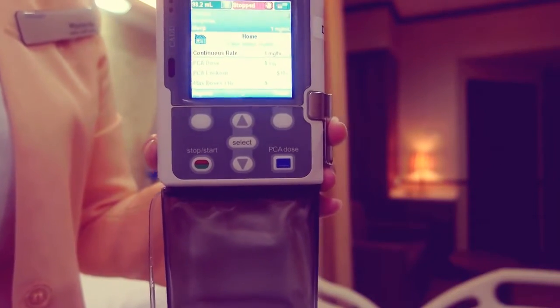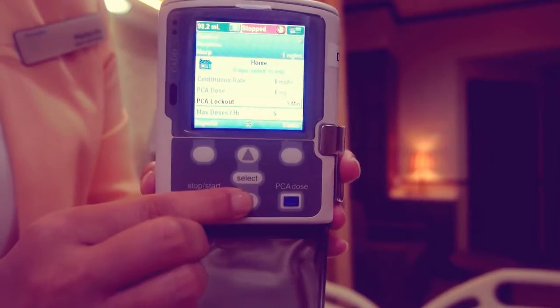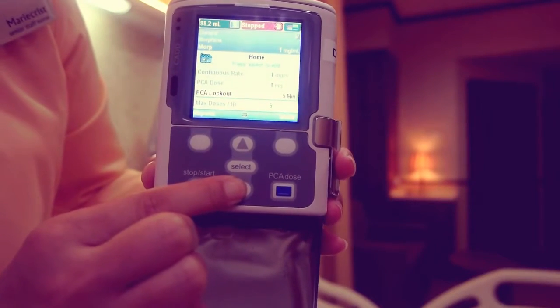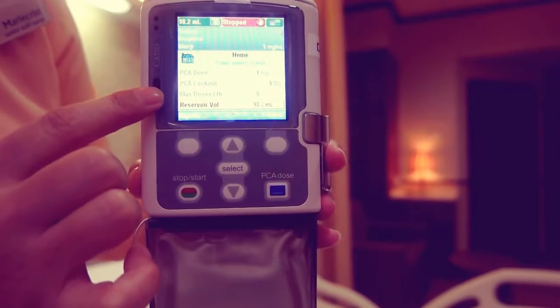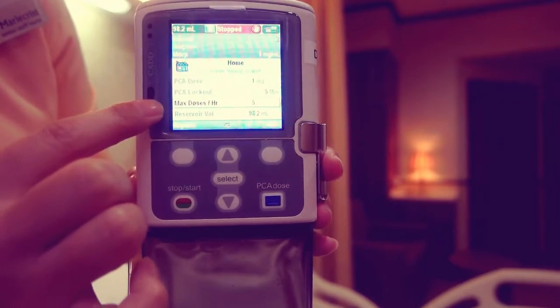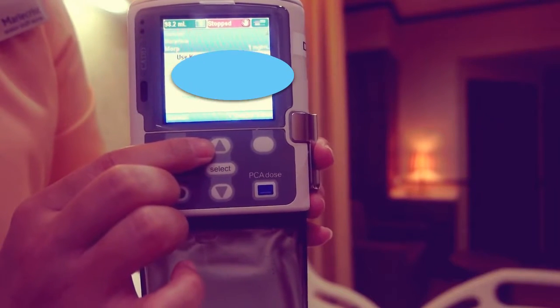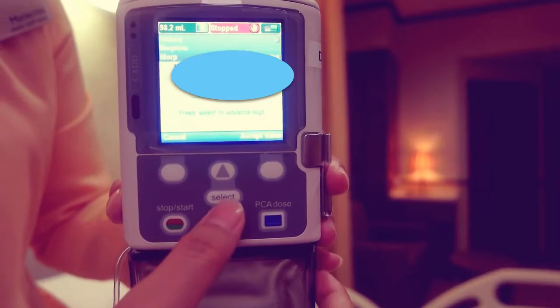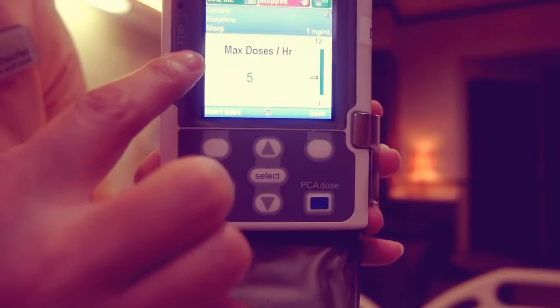Program the pump by scrolling up or down to highlight the patient's specific parameter you want to change. Then press select. Unlock the keypad using the security code. The patient's specific parameter is displayed.